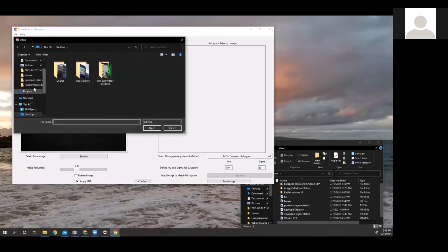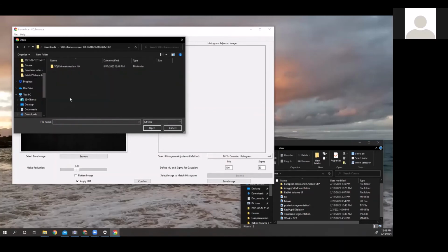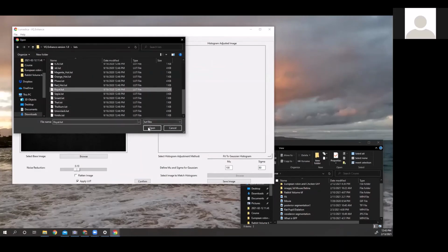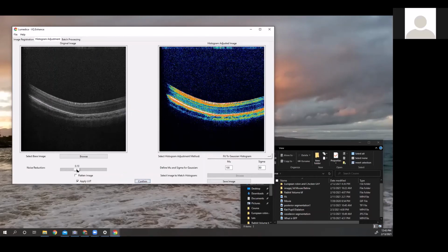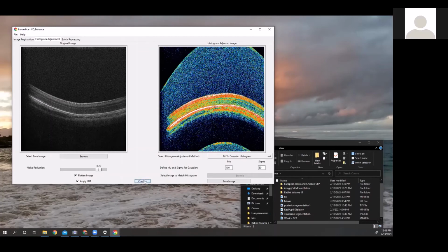So what he's doing is he's selecting a LUT. We want to pick some base images, and then we're going to pick a certain type of LUT strategy. There's a variety of them. He's going to pick Royal in this case, and Royal is going to apply a certain color spectrum to the grayscale of the OCT. That was kind of a random shot. You can see some of that layering effect is increased or decreased, and that accentuates the layering of the retina as well. It also makes for some very pretty images.